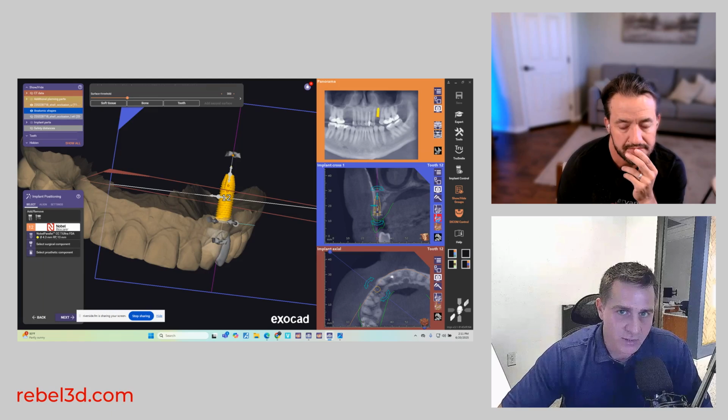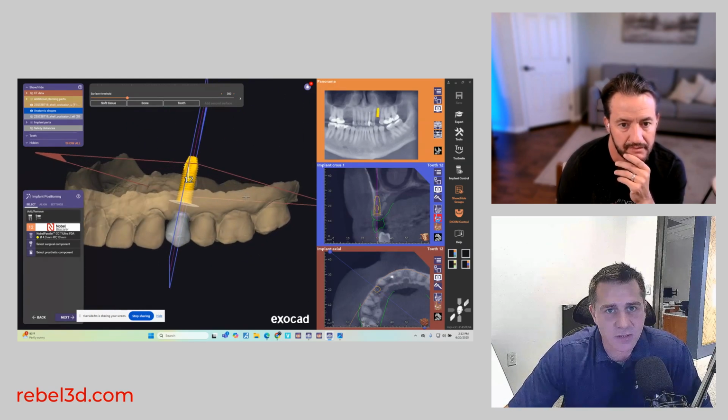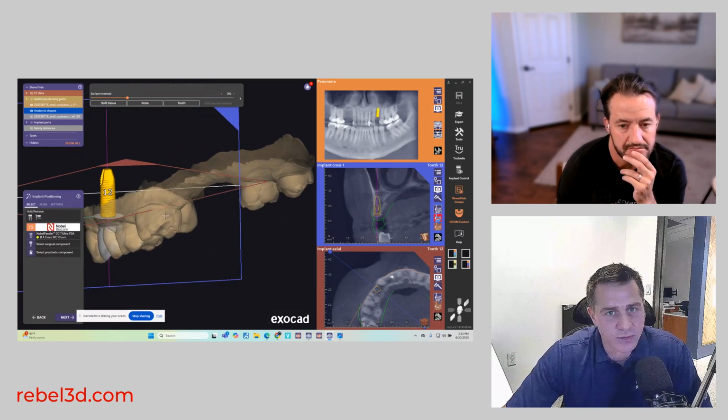You can even put a little marker in there and take an X-ray just to verify you're where you need to be. From there I'll flap it and continue with the osteotomy, then place the implant and visually see where I'm at from the flap, and then put a cover screw over it and close it up. I find that's the least amount of risk, especially on posteriors.